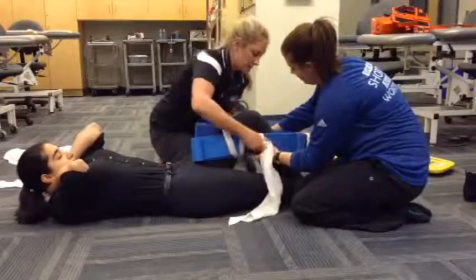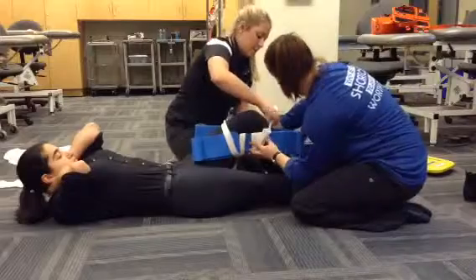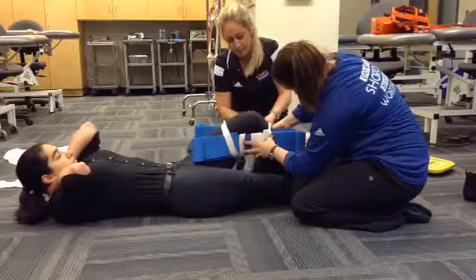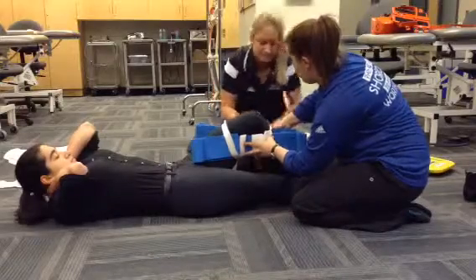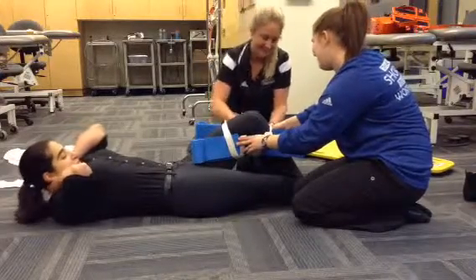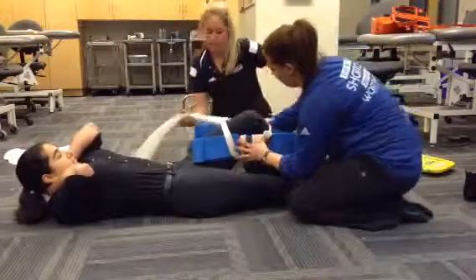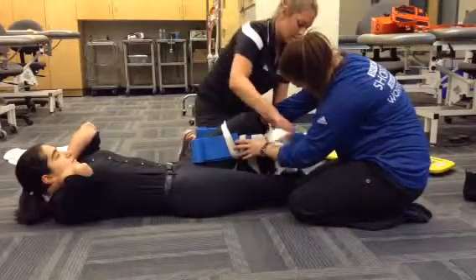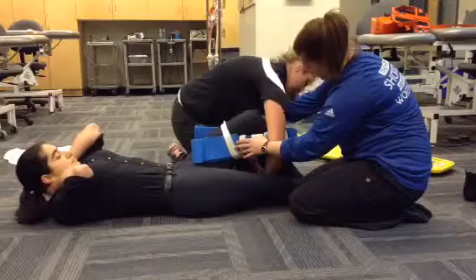Same thing on this side. Next we're going to come below the joint, starting underneath, stitching the splint together and tying on the side.